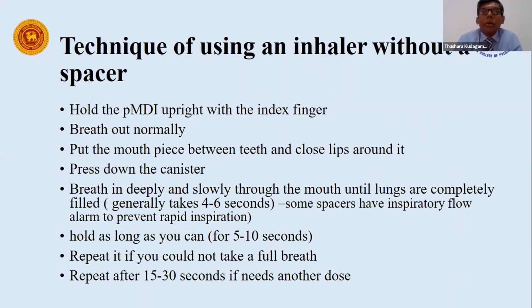Now, how do you use an MDI without a spacer? The MDI has to be held upright with the index finger, and breathe out normally, keep the mouthpiece between the teeth and close the lips around it. Press down the canister, and it's very important that you breathe in deeply and slowly.